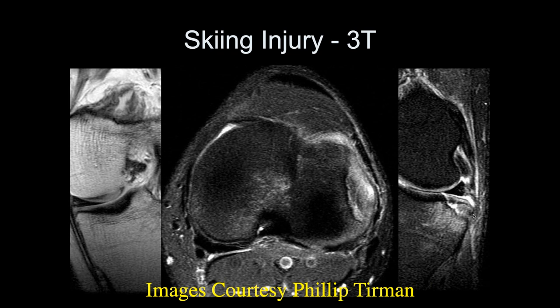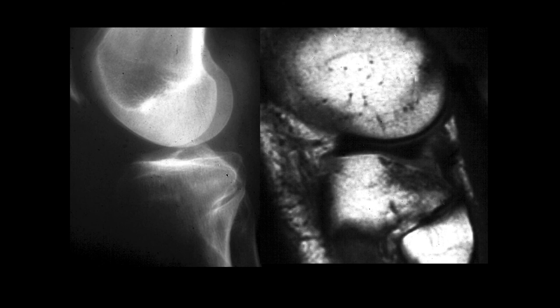Michael, this was part of our original knee MR study that we did, a patient of Rick Reus, and he came in with knee pain, and Rick called up and said, I don't need an MR scan, but do you guys want to do a free MR scan to get some data before I take him to surgery? So this is the lateral X-ray. That's right. Okay, so now we can see that there's an impaction fracture of the posterior lateral tibial plateau.